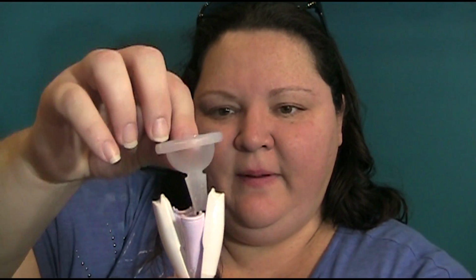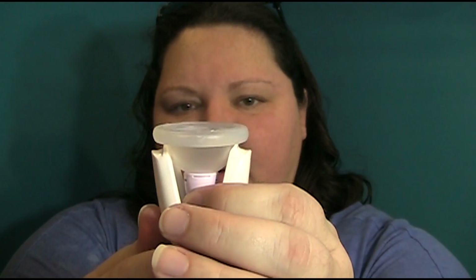So this purple bit is already in here like this, and you put the cup in here so it's resting on those two petals there. You can see they're kind of concaved, so they're resting on there, and then you pinch this closed. See if it'll let me pinch it back closed. Okay, and you pinch the purple things together and this sits right on here like this, and then you pull this plunger down, and what it does is it closes this up and it pulls everything down into it. None of it's going to work now because as soon as you hit the third button, everything releases. But it pulls it all down nice and taut, and then it looks like this.